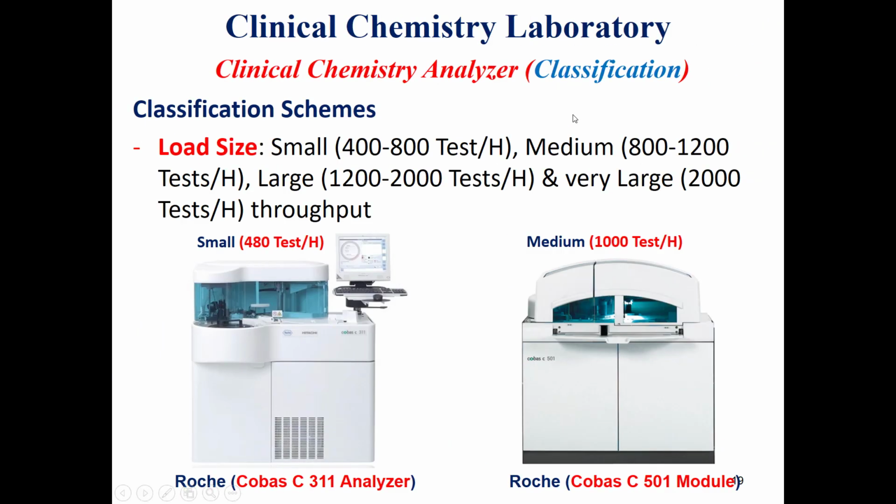Another type of classification scheme will be the load size. We can classify the clinical chemistry analyzer as either small, medium, large, or very large, depending on the load size. We have the same analyzers or models which are manufactured by Roche.